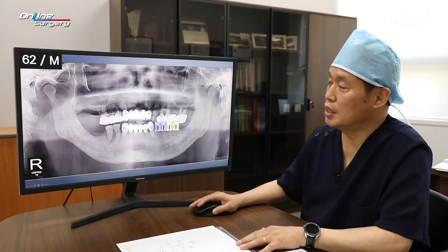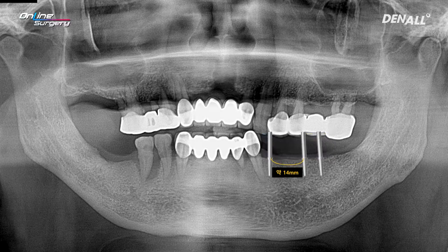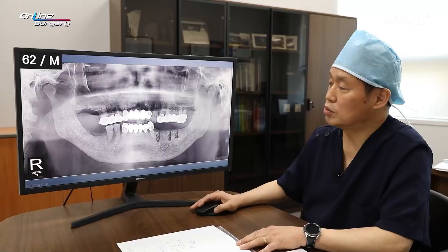As you can see, behind the canine premolar type single guide, two of them were used and two molar type guides were used to get position, and you can see the occlusion with the antagonist. Number four and number six — the distance between them was 14 mm — and a bridge was used so that 14 mm spans these two implants. This was the implant placement plan.